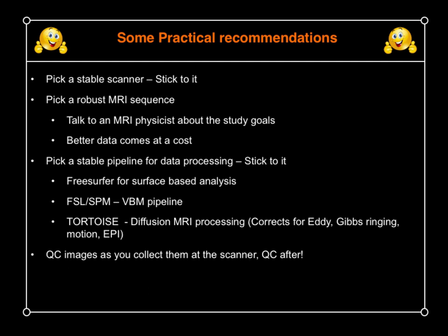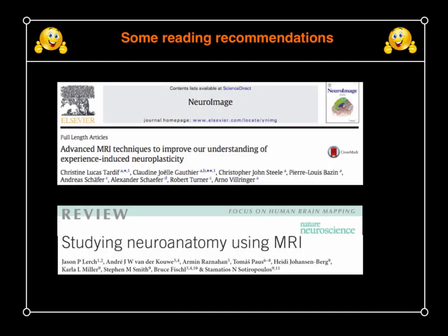Once you process the image, it's worthwhile to QC it after. And be consistent with your instructions to the subject. If you tell one subject to go to sleep and the other one to stay awake, or if you don't do any of these things, there might be nuisance-related factors, like more motion if someone's sleeping, since they tend to wake up suddenly and that kind of stuff. So you want to be consistent with your instructions to the subject.